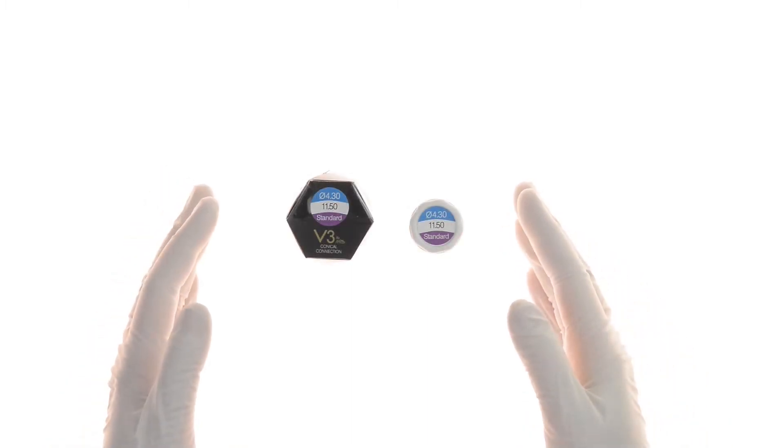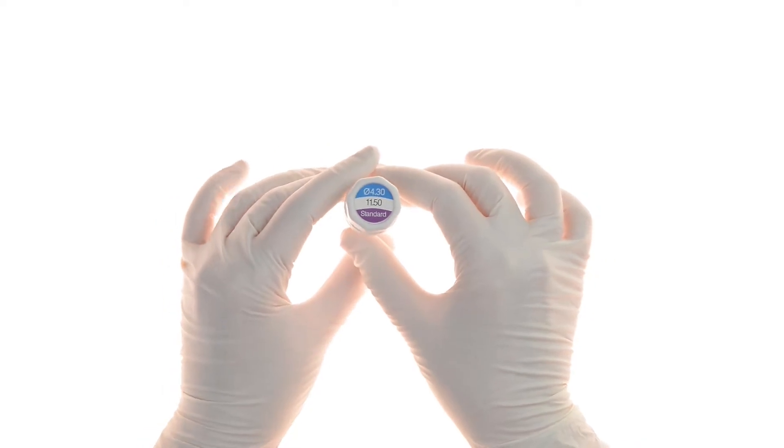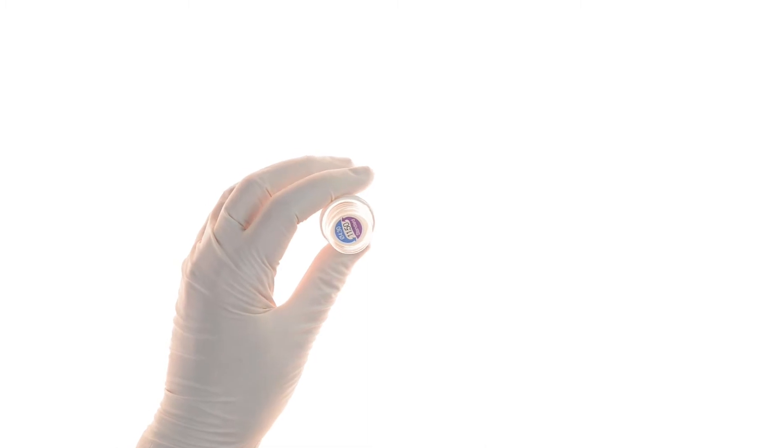This is the V3 implant by MIS. Today we will place a 4.3 diameter V3 implant using the comprehensive V3 surgical kit in a premolar site for tooth 44.